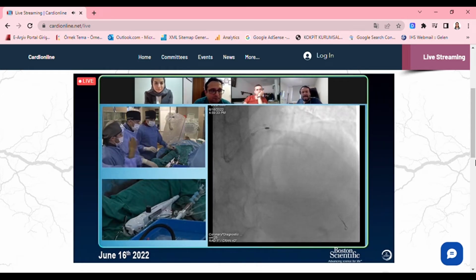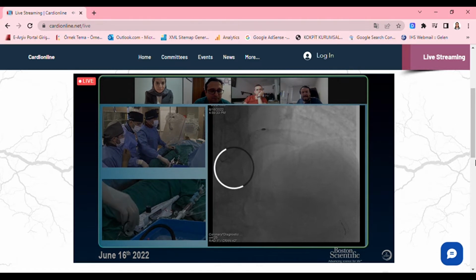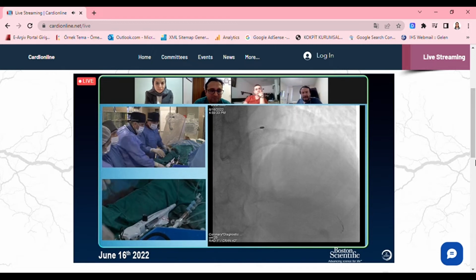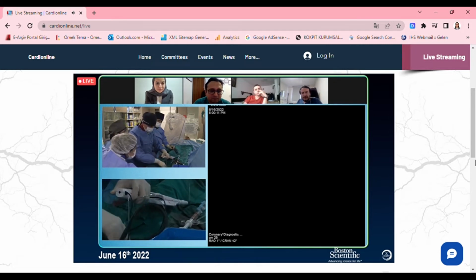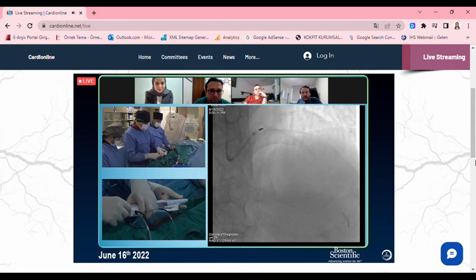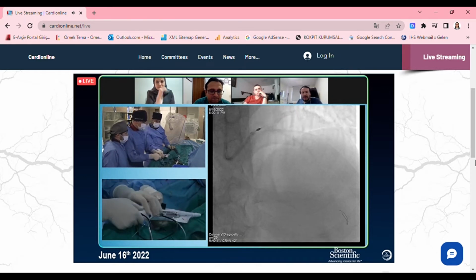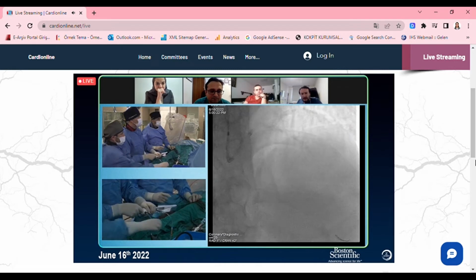Right, thank you. Let's go again with the dynaglide mode. We will remove it by pushing the wire. I'd like to show you how we do it. The Y connector should also be opened. That's another thing. Yeah, press it, please.